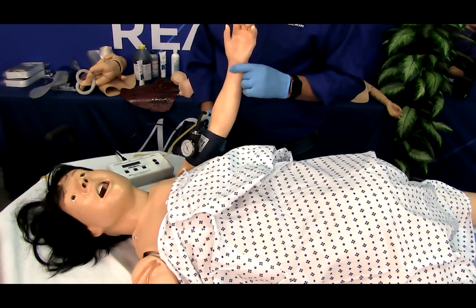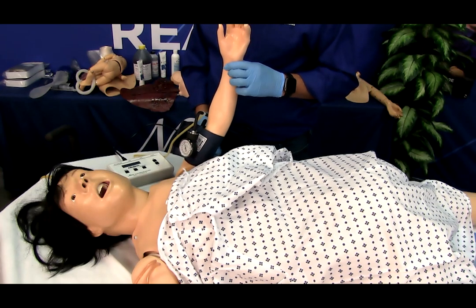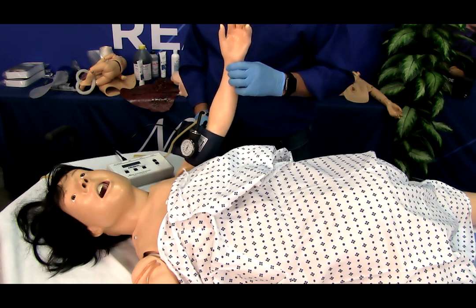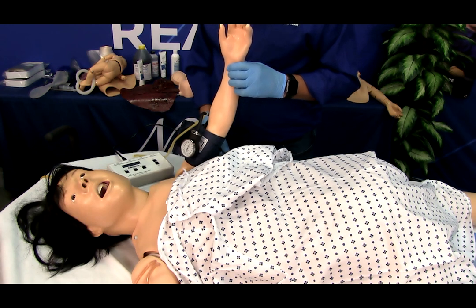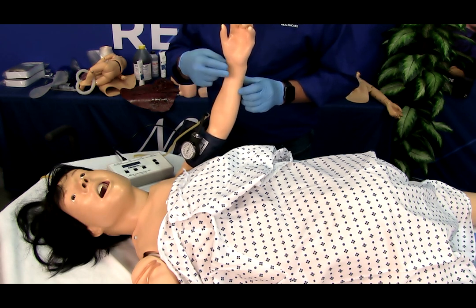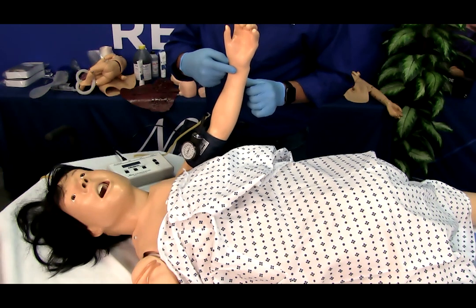To set the auscultatory gap, locate the gap key to the right of the menu key. Press the gap key to set the function on, Y equals yes, or off, N equals no. When the key is pressed, a message will briefly appear saying the auscultatory gap is enabled or disabled. The main display window will show A gap Y or on, or A gap N or off.